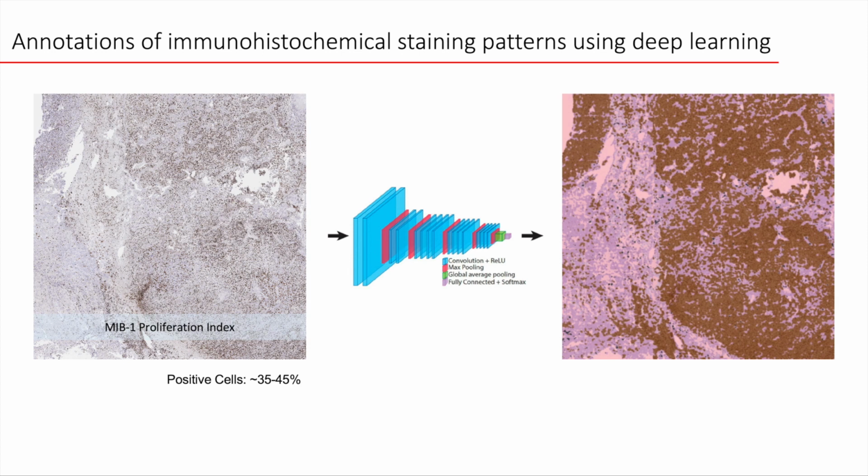So when we run it through a neural network trained to recognize different proliferation indices, you can see that not only do we get a nice pseudo-color map of where the proliferative capacity is on this slide, but we also get a distribution score for the global average of the slide, and it can also break it down into different percentages in different regions. And I think that is a really, really important way to start documenting this data in a much more advanced and complex way.